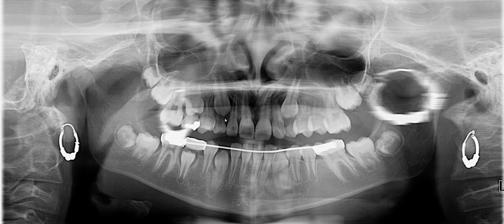As for the maxillary canine, it's a little harder to tell. You could argue that the cusp tip of number 11 is ever so slightly lower than that of number 6, but they are very, very close to one another.